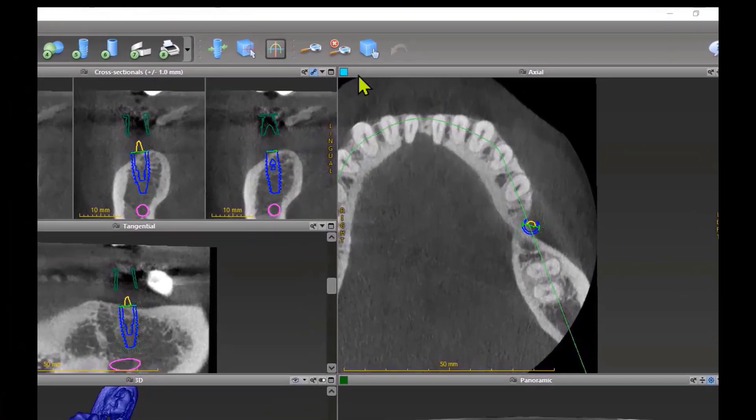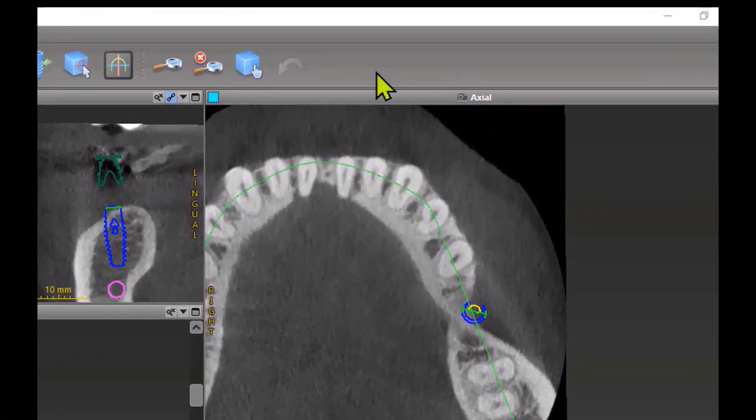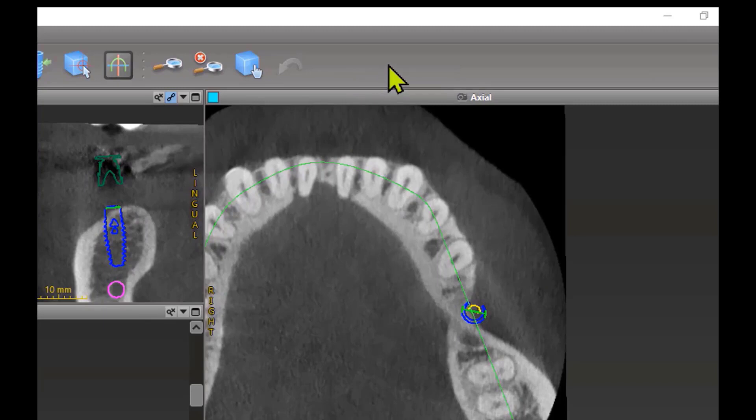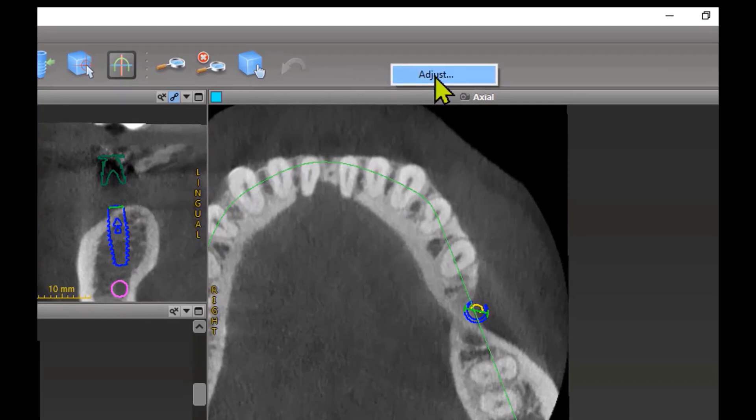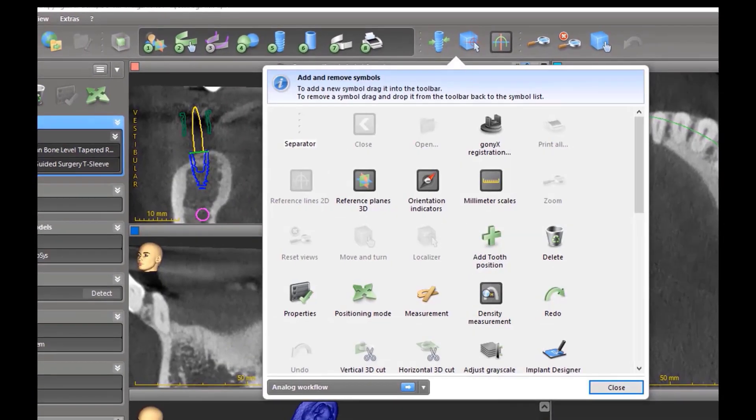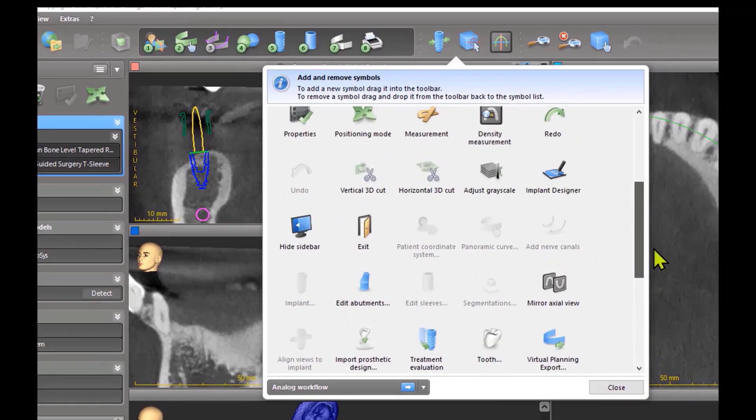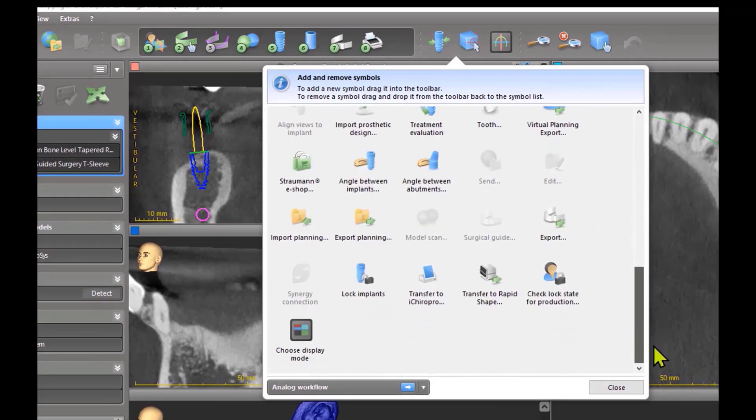CoDiagnostics allows you to modify your top bar. Click on the top with your right mouse button. You will see Adjust. Click on the button and a window with a lot of possibilities will open. My most preferred button is Display Mode.